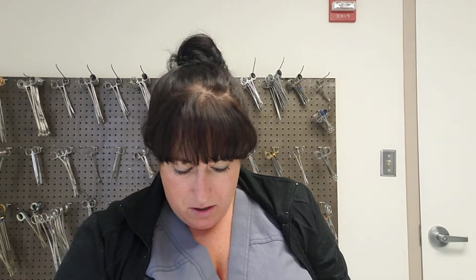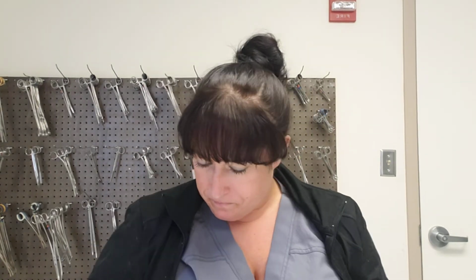Because of the delicate nature and pointiness of the end of the tips, you're really only going to use these for more delicate surgeries, maybe a wrist in orthopedics or something like that. It doesn't have to be orthopedics though, it can be a lot of different things. So let's just stick with delicate surgery for now. So that tip was really small, right?